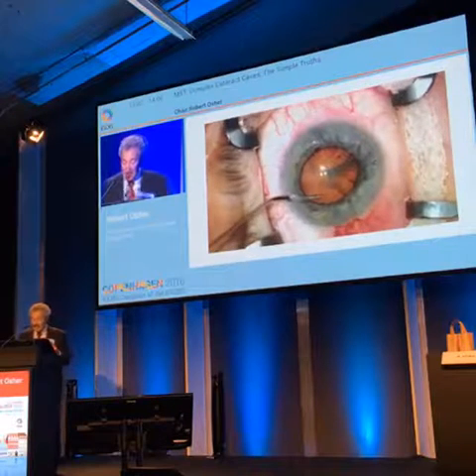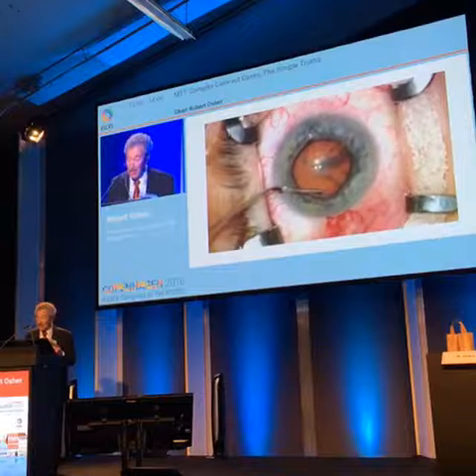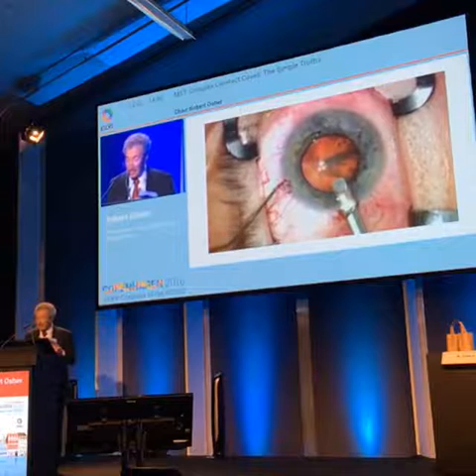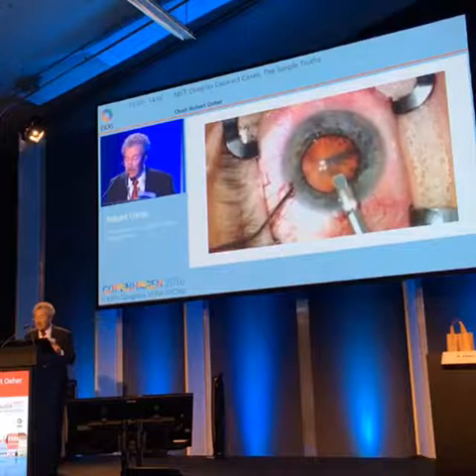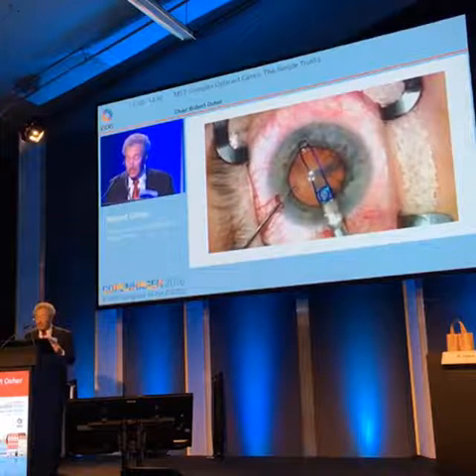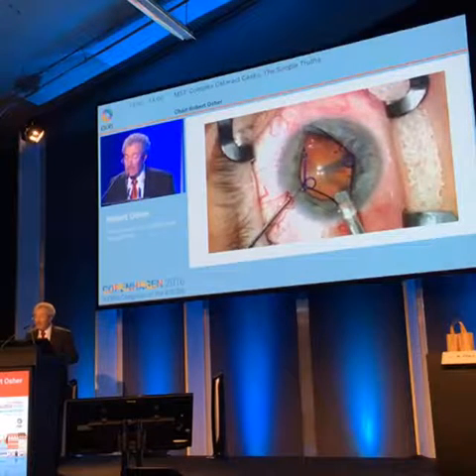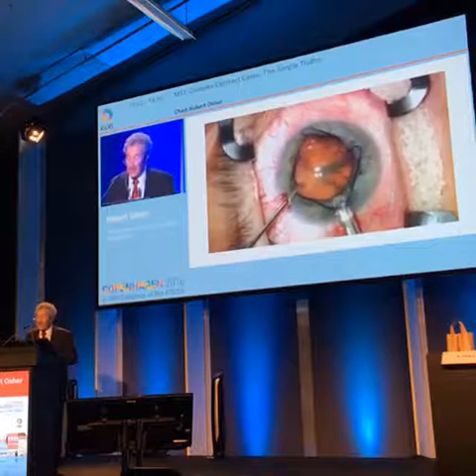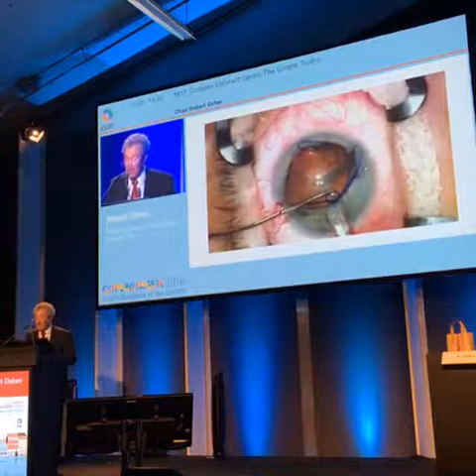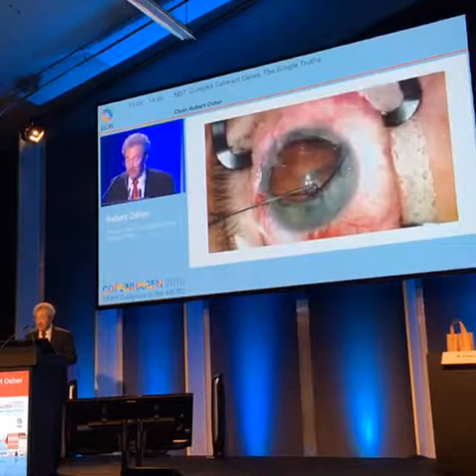I make a second stab so I can lift up the subincisional iris off the anterior capsule. And now I bring in the injector, which will go through a 2 millimeter incision. This is a 2.2 millimeter incision. And the new ring, which will enter the eye. It's no longer 4-0, it's 5-0. The scrolls are a little larger and easier to engage. The ring is more compressible, and it is very easy to insert.